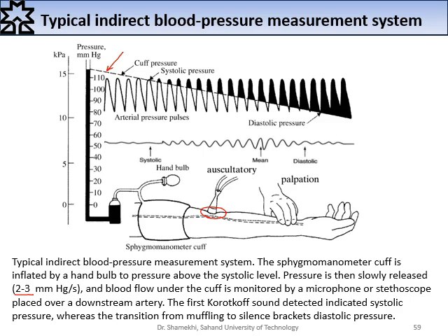Before this point, where the cuff pressure and systolic pressure are the same, we don't have any flow. Therefore, we cannot hear anything.